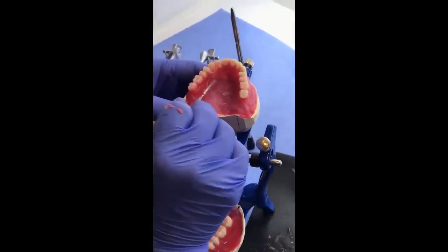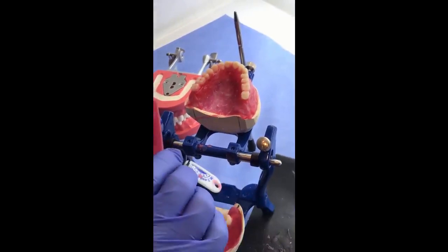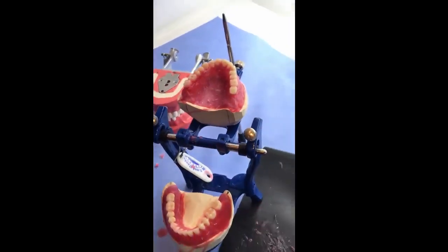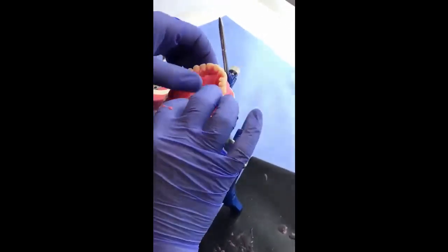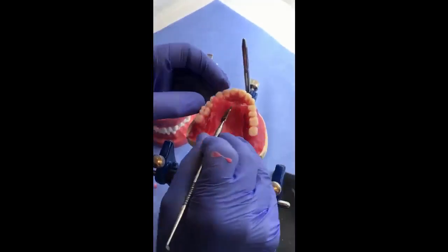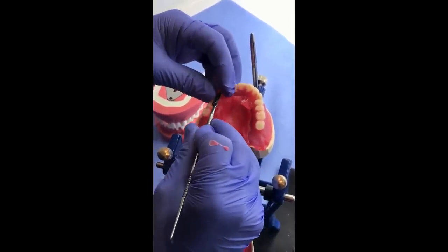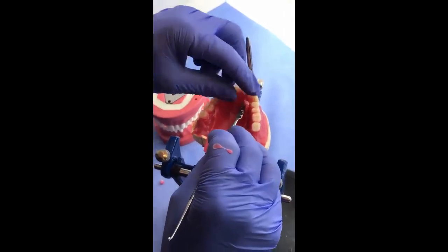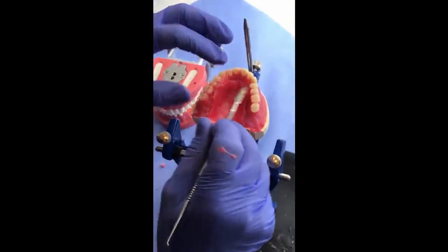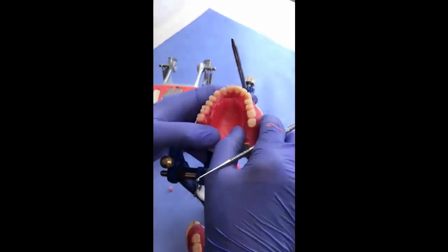collected in the area during the arrangement of teeth. You have to expose the record base. Then we can adapt a piece of wax, base plate wax, to the area, as if you are adapting the record base. And you can contour it, and cut the edges here.